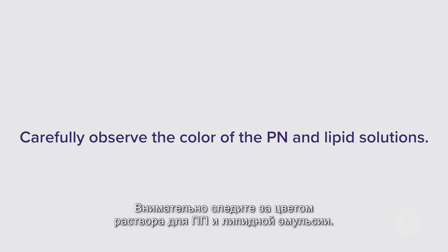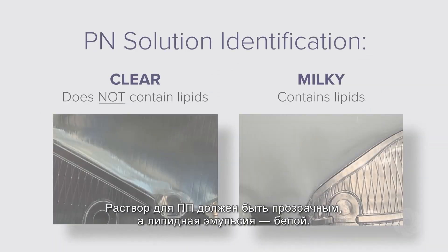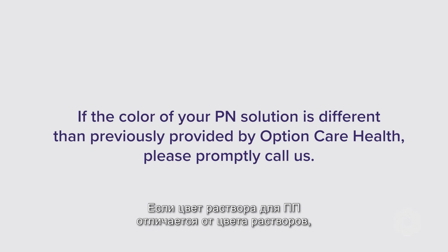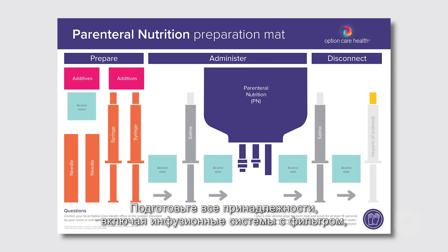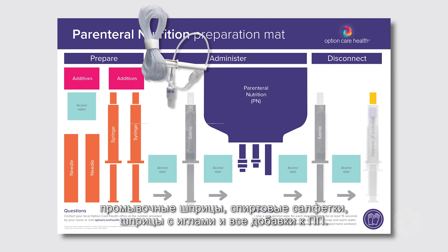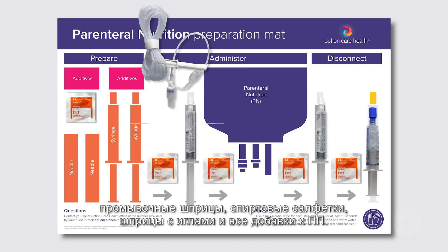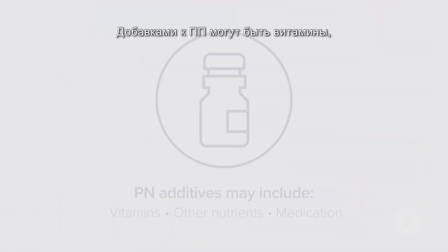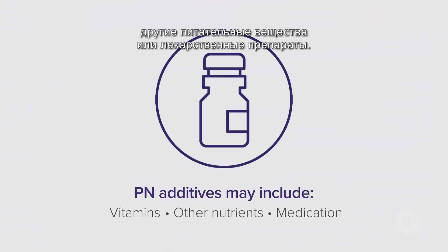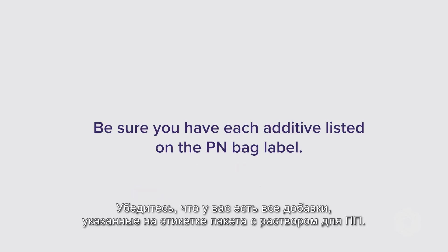Carefully observe the color of the PN and lipid solutions. The PN solution will be clear and the lipid bag will be white. If the color of your PN solution is different than previously provided by Option Care Health, please promptly call us. Gather all supplies including IV tubing with filter, flush syringes, alcohol wipes, syringes with needles, and any PN additives. Place them on the PN preparation mat as indicated. PN additives may include vitamins, other nutrients, or medications. Be sure you have each additive listed on the PN bag label.